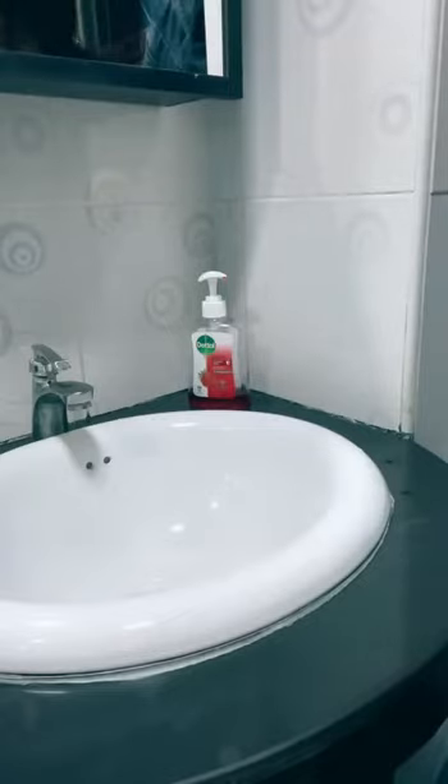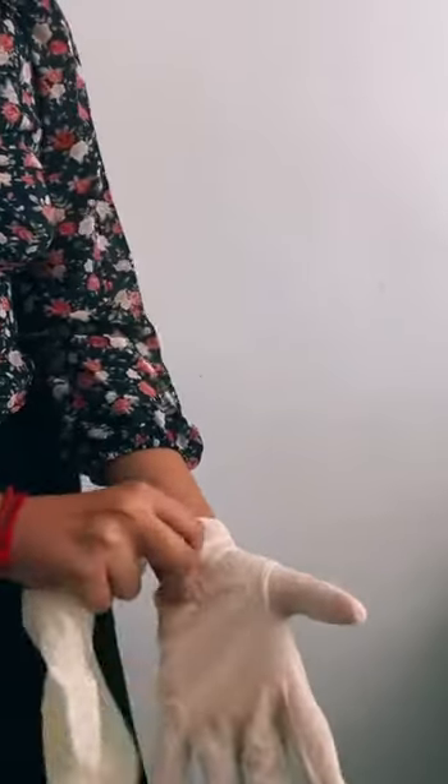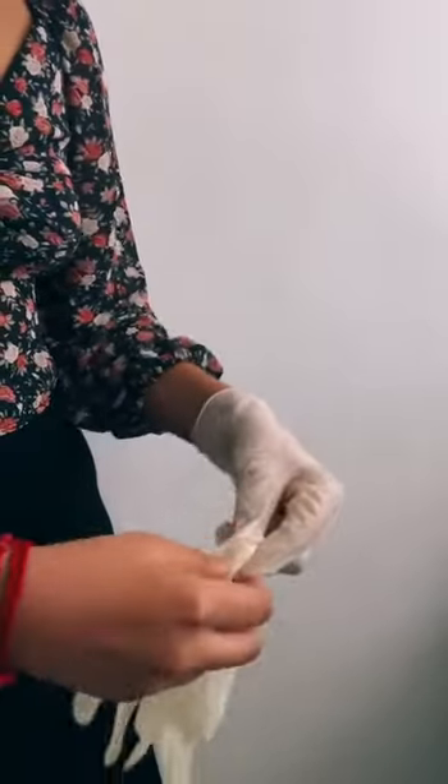Start by washing your hands properly. Second, you can always wear sanitized gloves. Rub a glove to ensure a more hygienic environment.